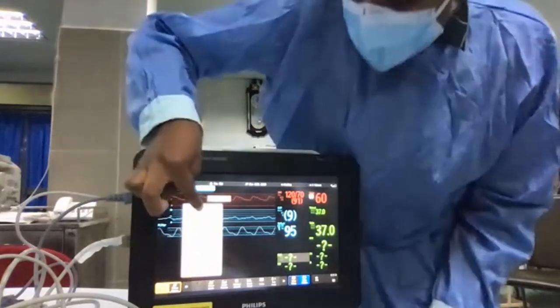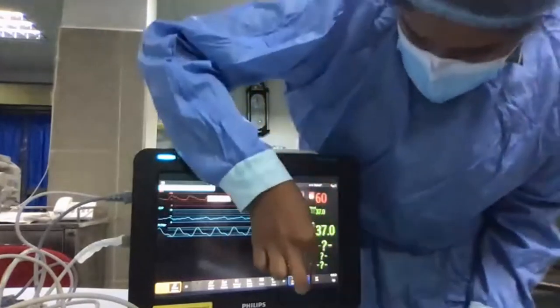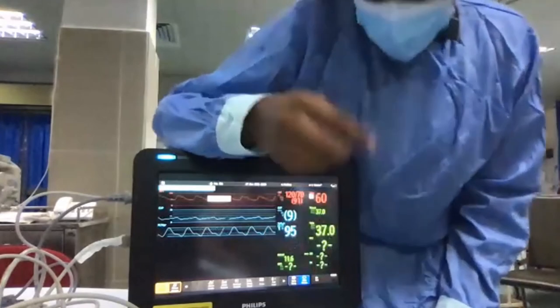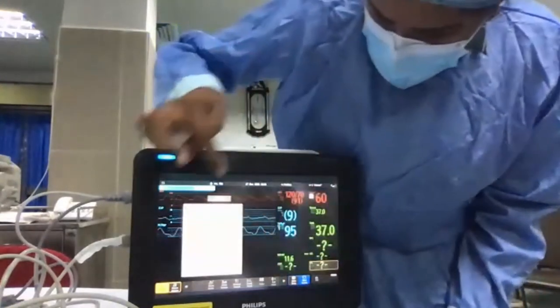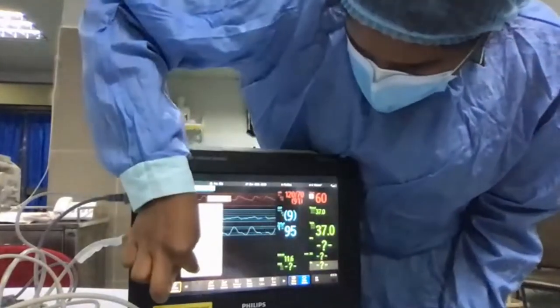EVLWI. Okay, click on that. That will come. And we'll do another one. I want to get SVRI. I'll get it over here. Click on it. Scroll down. Change numeric. Scroll down.